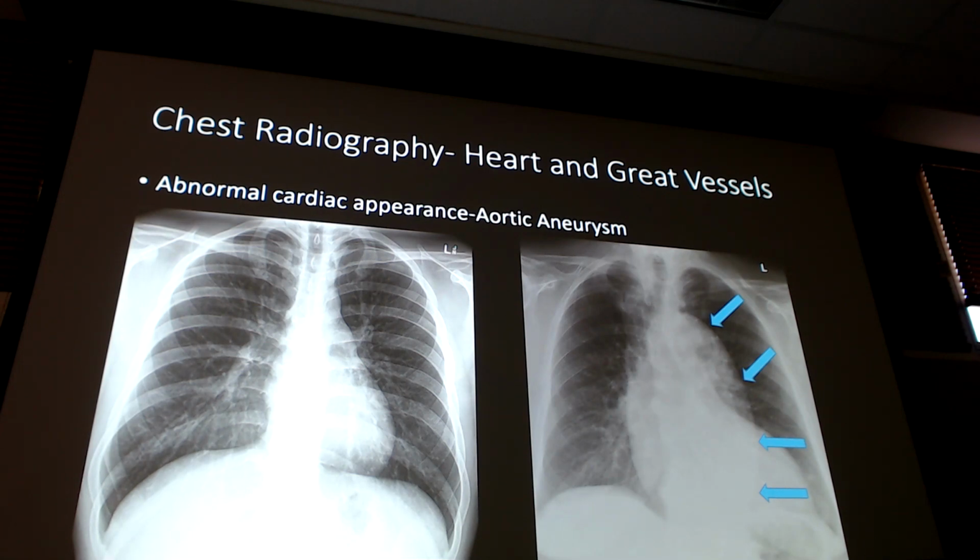X-ray alone, I don't. I have no idea, right? And especially if the patient is asymptomatic and they're coming in, I have no idea. So what am I going to do with this patient next? CT with contrast to further evaluate that to figure out what's going on. So this is one of those examples where you get an x-ray as the initial study and you go, oh, this could be 3 or 4 different things. If I have a patient presentation that leads me towards one or the other, I can develop a most likely, right?